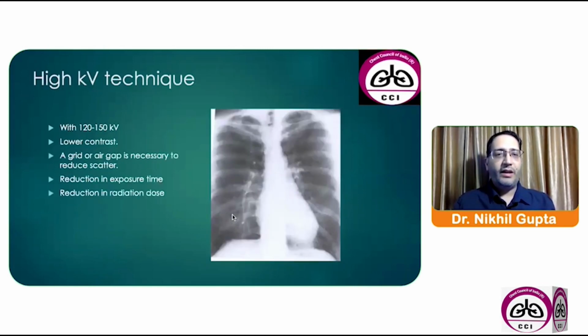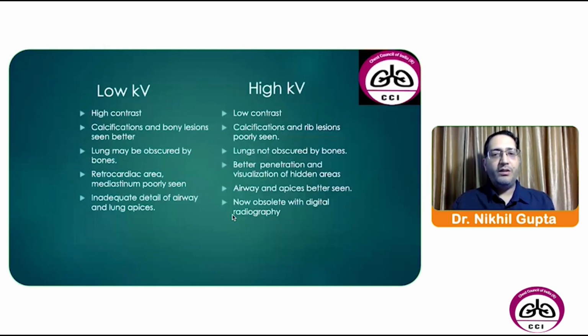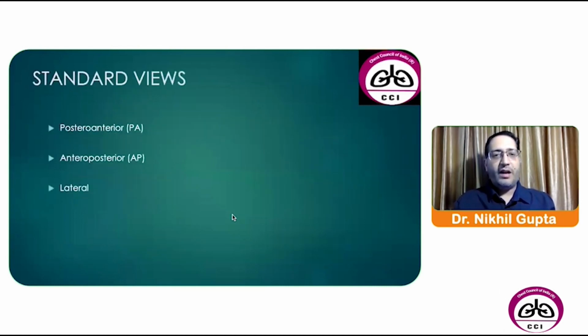Coming to high kilovolt technique, it is obtained with 120 to 150 kilovolt, has a lower contrast, a grid or air gap is necessary to reduce scatter, and there is a reduction in exposure time, also reduction in radiation dose. However, it is obsolete with digital radiography.